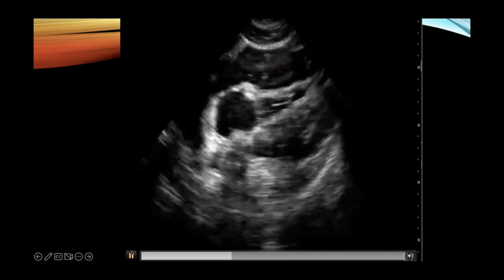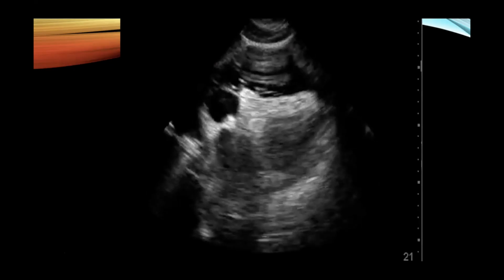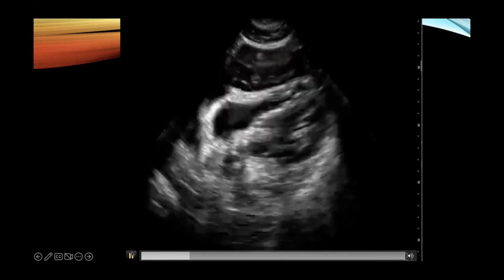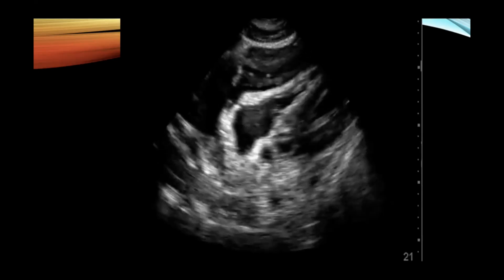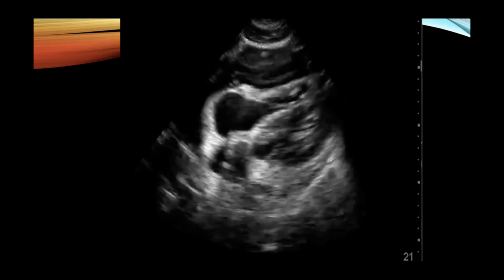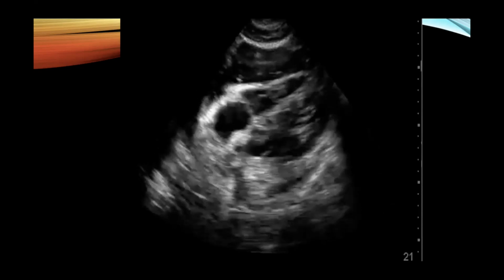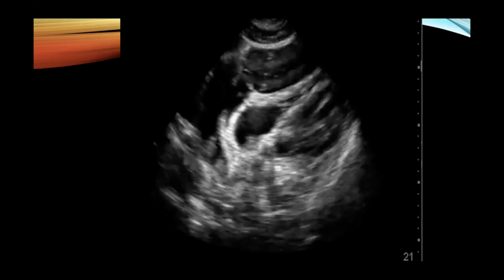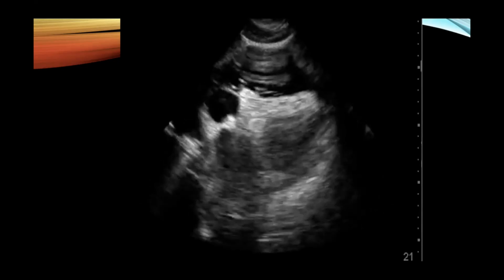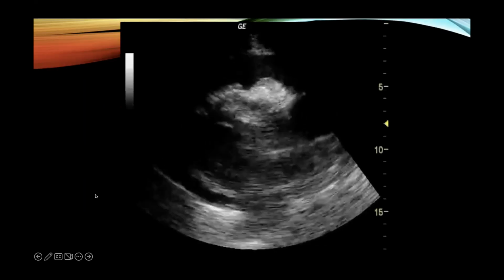I think I'm just saying right atrial systolic collapse. And what do you think about the right ventricle? Oh, it's compressed. Yeah. So what might this patient have? There's a special diagnosis. Is it not tamponade? Yeah, that's it. Perfect. Yeah, so that's what we're concerned about with this one. So Robbie might be able to stick a needle in this one. Awesome. Okay. Next.